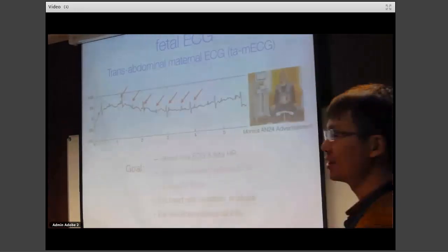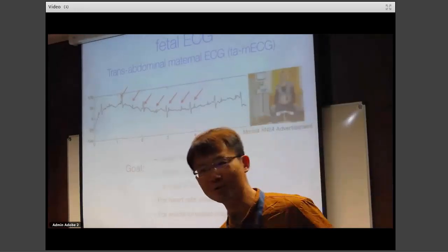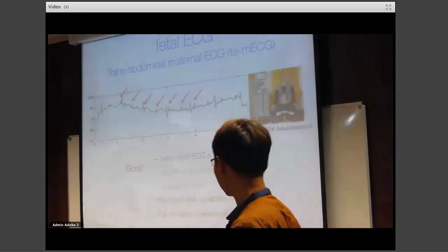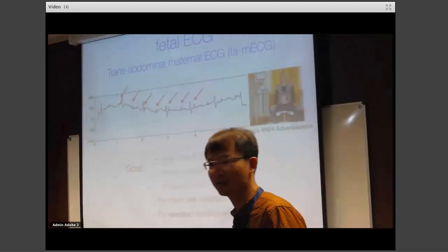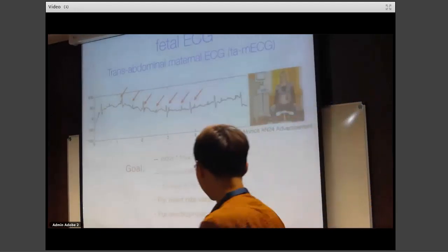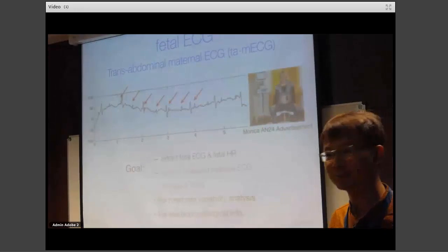Okay, so fetal ECG, I think I don't need to mention too much. All of you know much more than me. But you know what we want, several goals, right? You want to get fetal heart rate, and then you can understand the heart rate variability of the fetus, to understand the health, and even to get fetal ECG, and to try to get electrophysiological information, if possible.